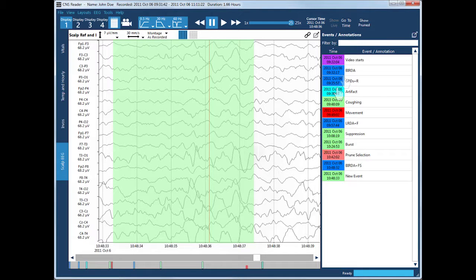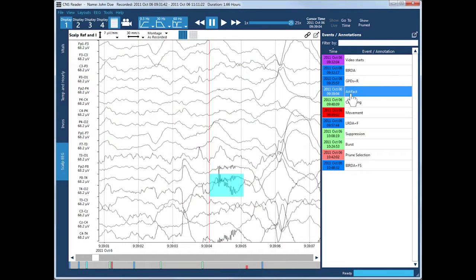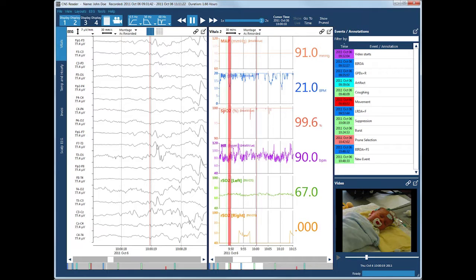You can review the list of annotations, sort by annotation name or time, and jump to the EEG for an event. You can also review corresponding physiology and video.